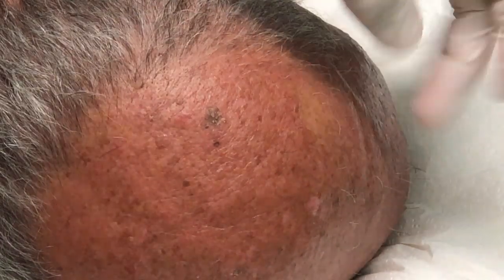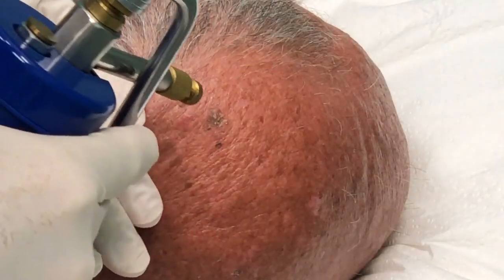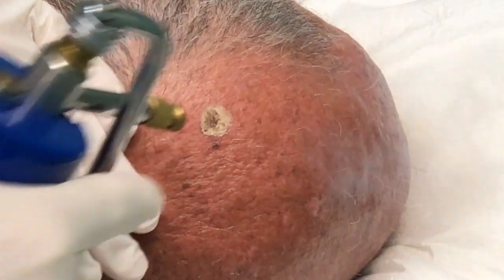Hang on for me. Here's another seborrheic keratosis. I'm blocking the camera, but you've got a little one over there. So we're going to get these. Are you ready? These are a little bit smaller. That one you had on the front was awfully thick. Yeah, it's a bad one. Then you have a little one I wanted to get right there. Don't go anywhere. We'll get it for you. There you go. We have to let these thaw.